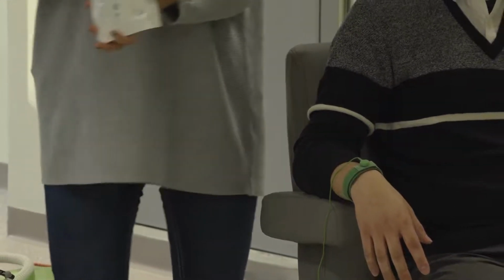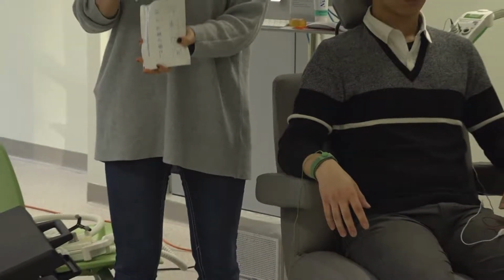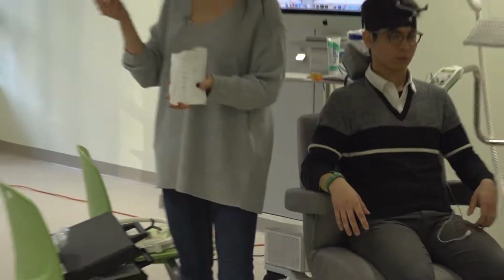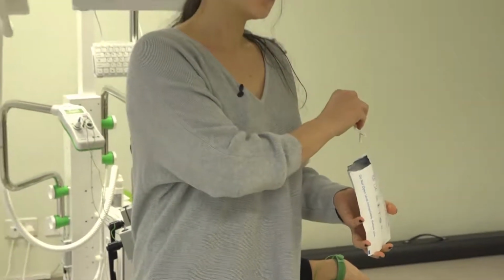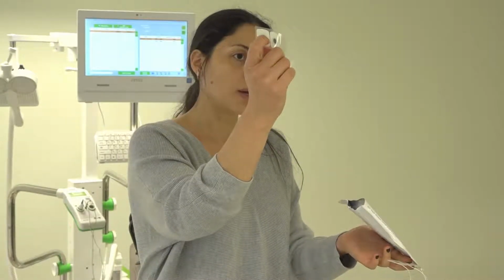And the electrodes. These are disposable electrodes. So you use them and you throw them away. You don't use them twice, okay? I found yesterday some electrodes that were facing each other, like one on top of the other. That doesn't work. You should not do that. They should be in this way.